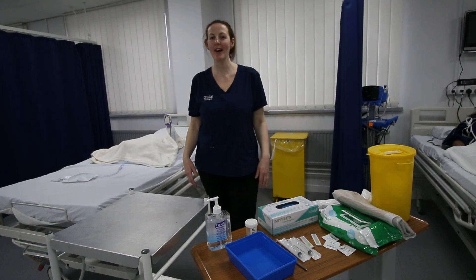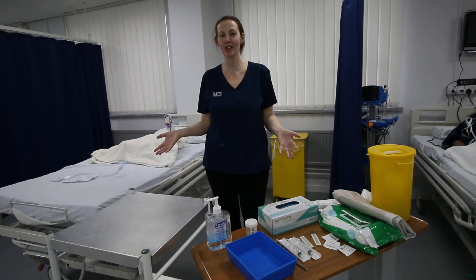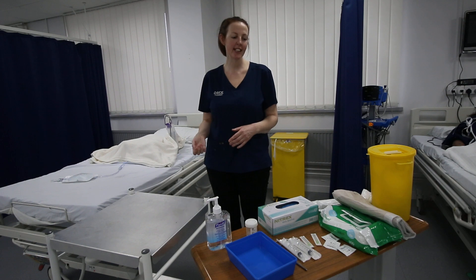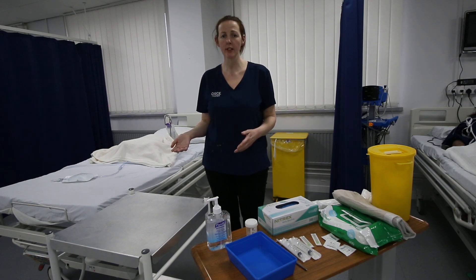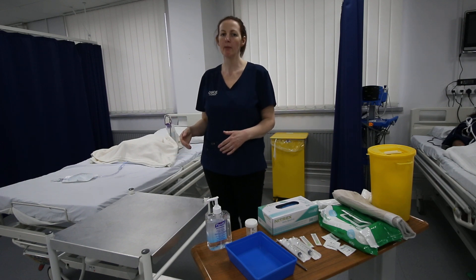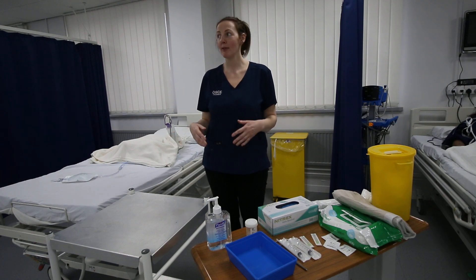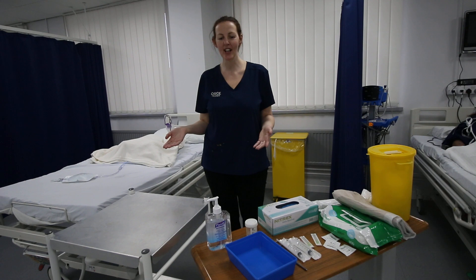Hi, I'm Mel and I'm going to be showing you how to do your NMC OSCE clinical skill of obtaining a catheter stream urine sample. Today we're going to be using the new protocol, so it's not the one in the Royal Marsden, but it's the one the test centres are accepting.